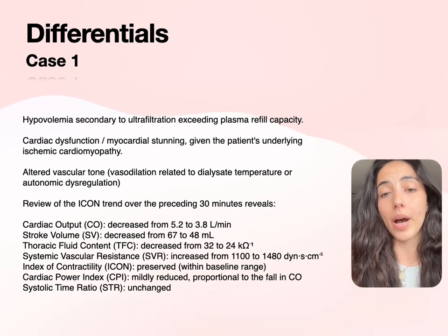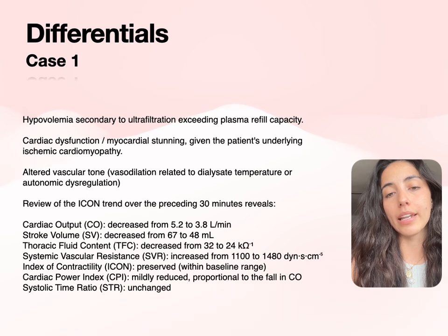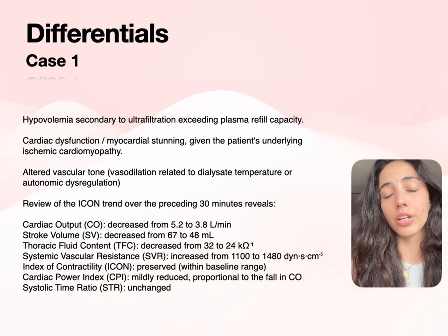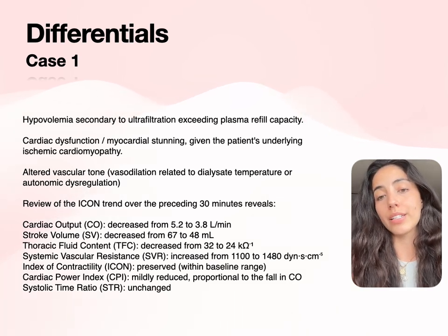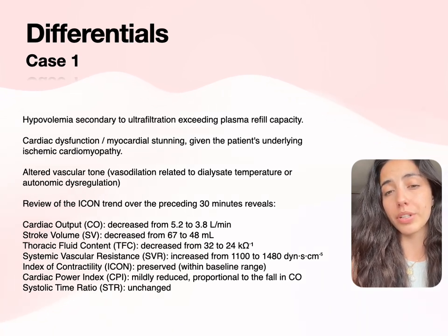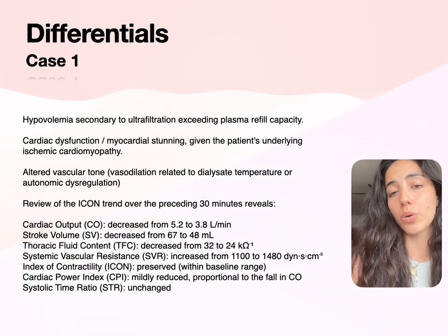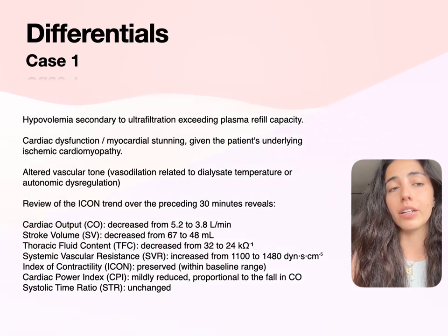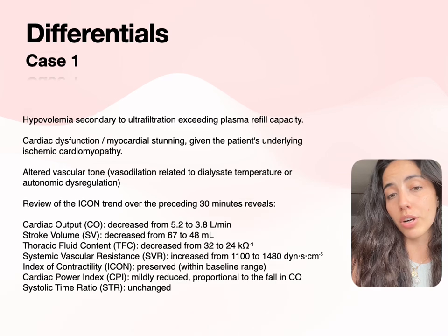This is essentially why it's important to have access to non-invasive techniques, and electrocardiometry is a very strong option for this. It can be used in patients that are receiving dialysis and can't necessarily receive invasive monitoring. It's not worth the risk, but it can allow us to gain very quick insight into specifically what is going on with a patient. And in the transport phase of patient transport, of course within neonates, but also adults, it can be a very strong option to consider.